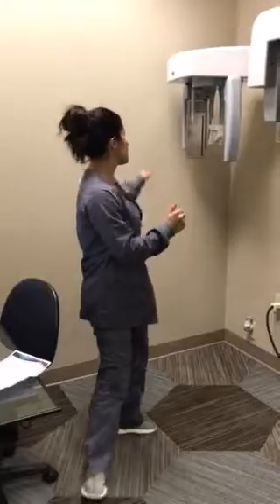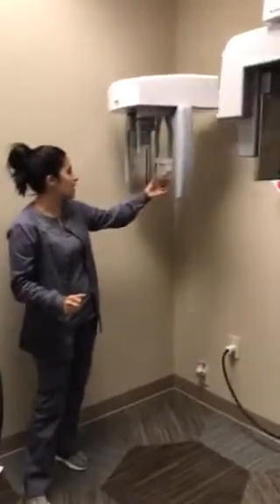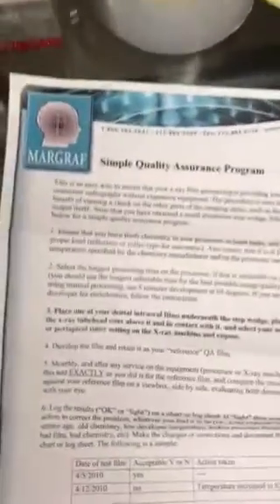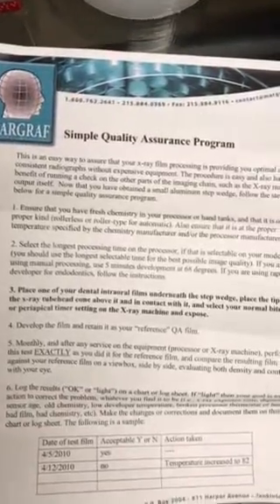So we got these things called step wedges. We got a big one like this and a small one that we use in the actual room for the regular x-rays that we take for bite wings and stuff. But this big one, we got it from a company called Margraf, and they simply told us to tape it to the actual sensor. When we did that, it didn't work.